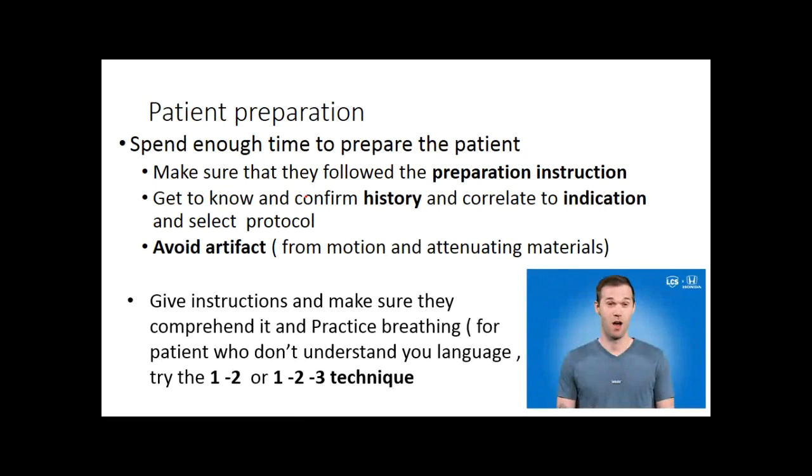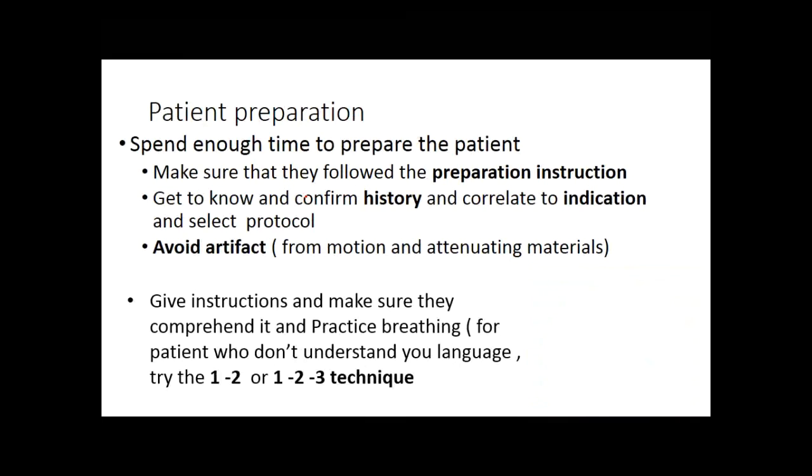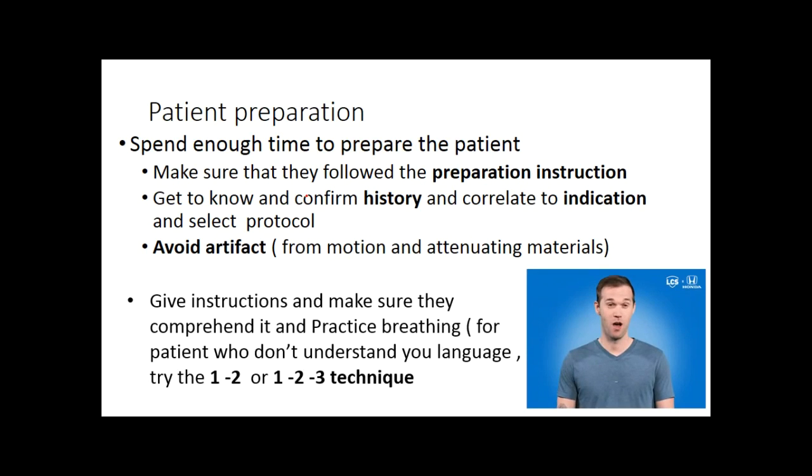So, for example, 1, 2, 1, 2. You do this while you are showing the patient how it is done. If you want them to take a deep breath and stop, you count 1, 2, 3 and stop. This is the 1, 2, 3 technique.